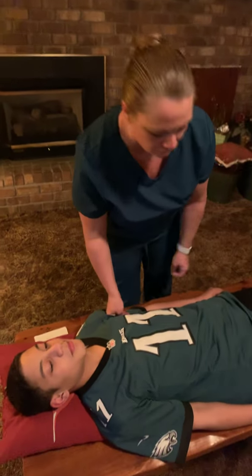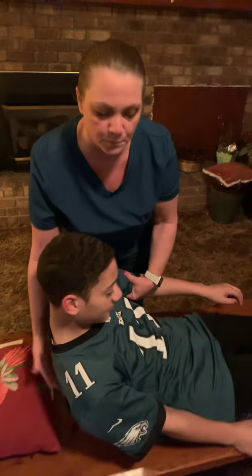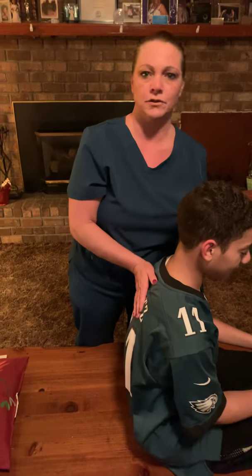You'll take your leads off. Set your patient in a comfortable position and wait for the physician to come in after he reads it.